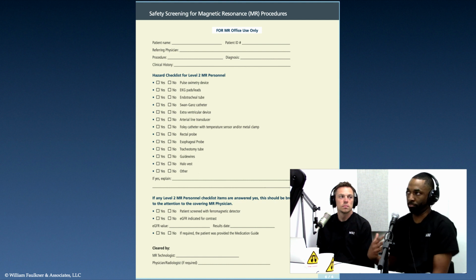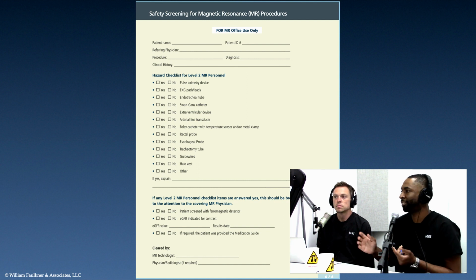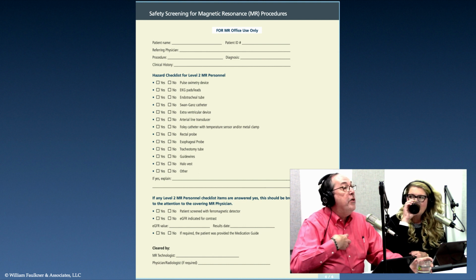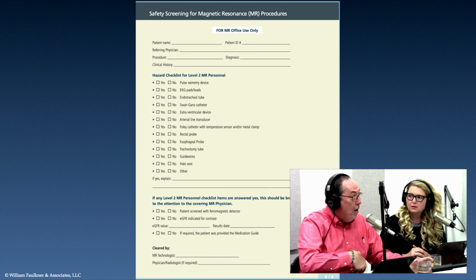And people sometimes might forget because they don't have the pacemaker. Oh, it was taken out. And we'll check X-rays, and almost every time they have leads. Oh, yeah. Any time a pacemaker is going to have a lead in the heart, it's going to have not an epicardial one, but one in the heart.